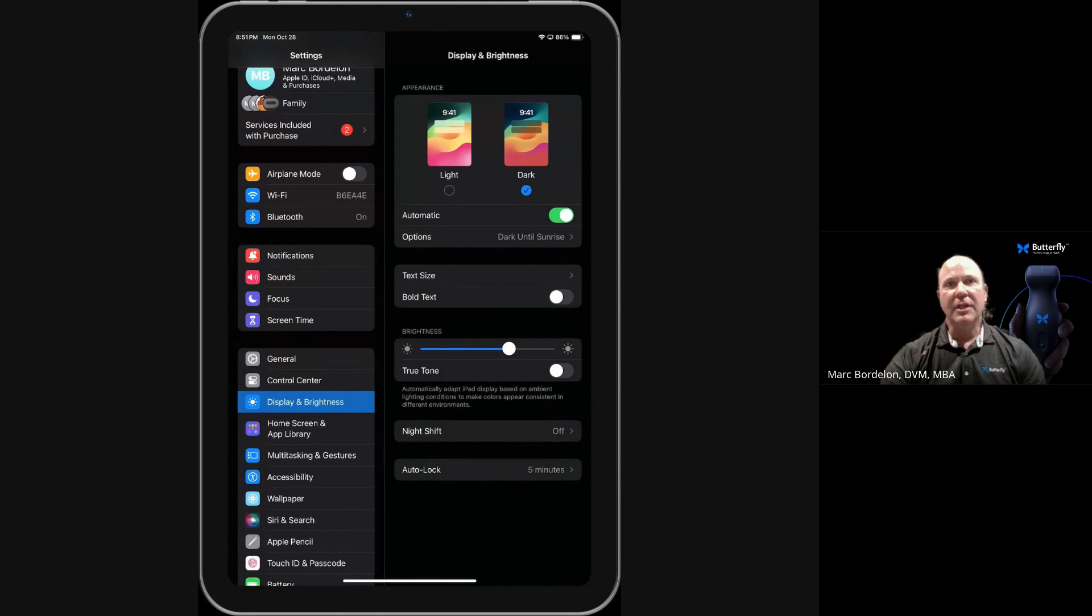Those are the two settings you need on any iOS device to help optimize an image when using the Butterfly app.